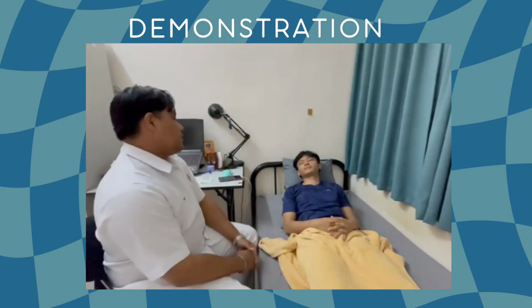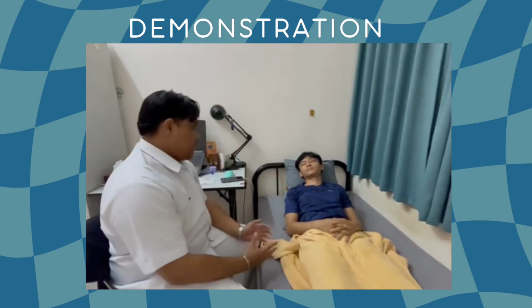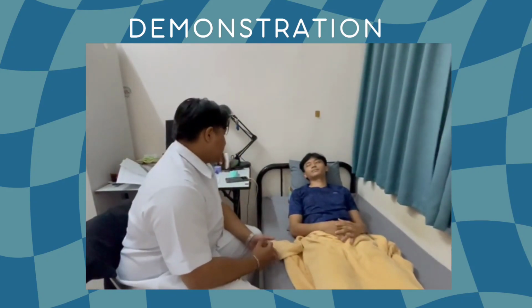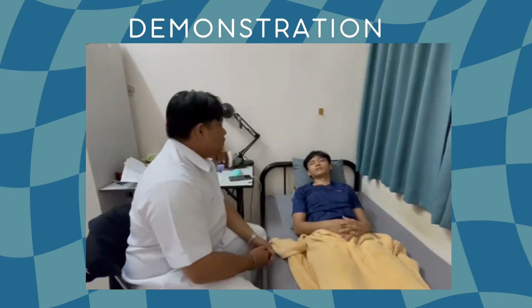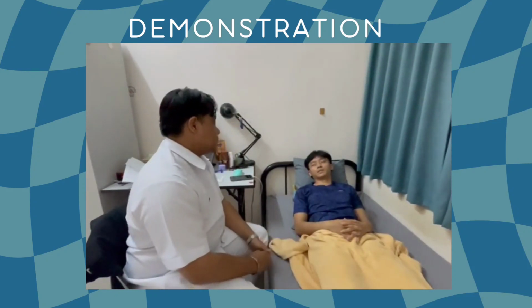So today I would like to talk about how to protect your right eye during your recovery. Our purpose is for you to use the eye shield to protect your eye when you're sleeping, so it doesn't put any pressure on you, or when you're going out in public or being exposed to dust.